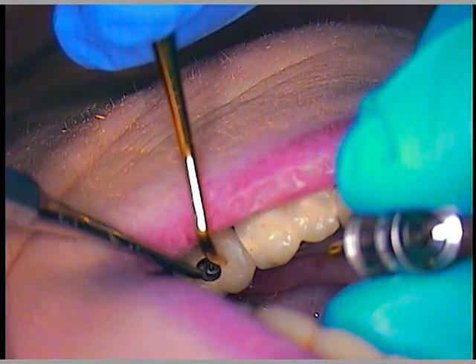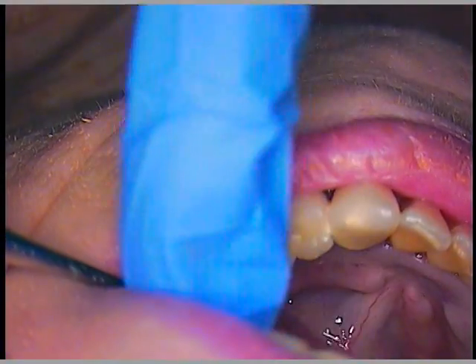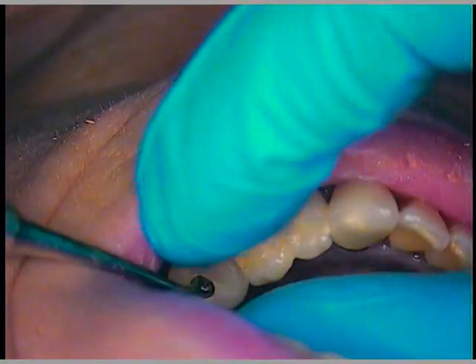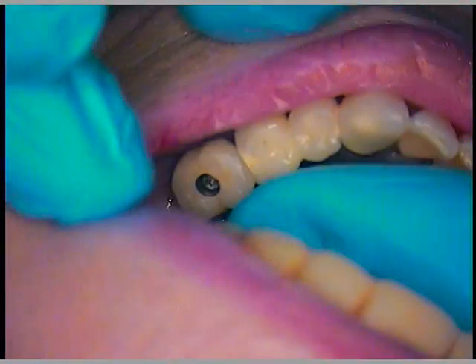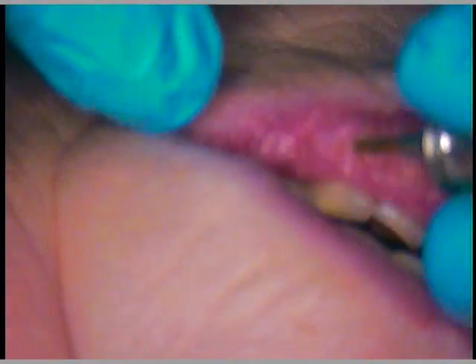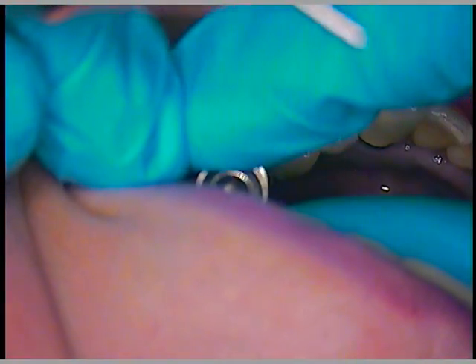I'm getting your lip — I can see that. A little Vaseline right there would be good. She's cut right there, sorry. The screw's almost in but I just wanted to make sure everything was aligned properly — I'm still hand tightening. Yes, the skin is very thin. Thank you, sorry about that.